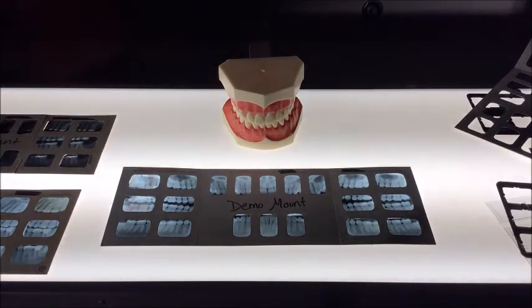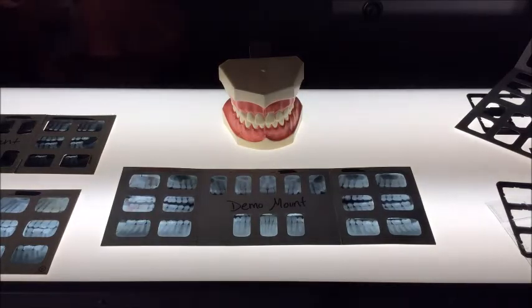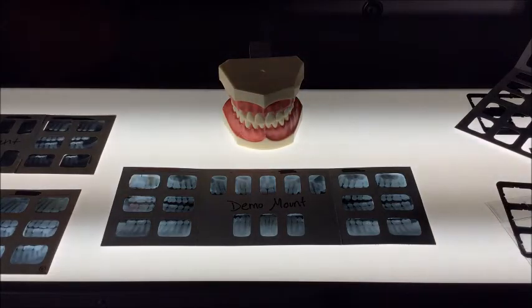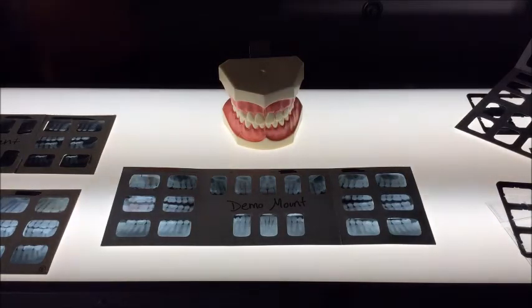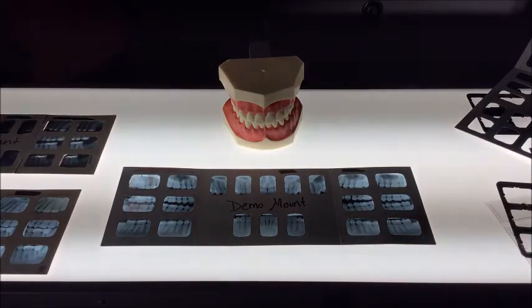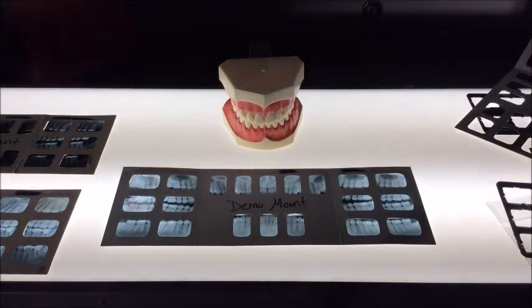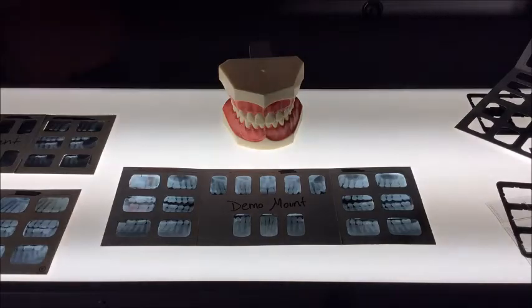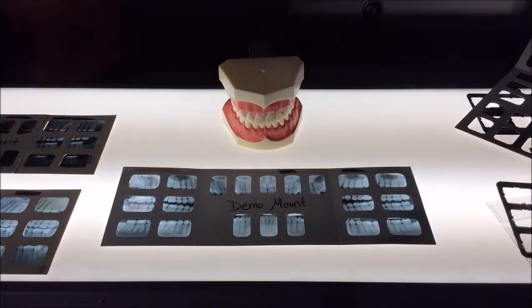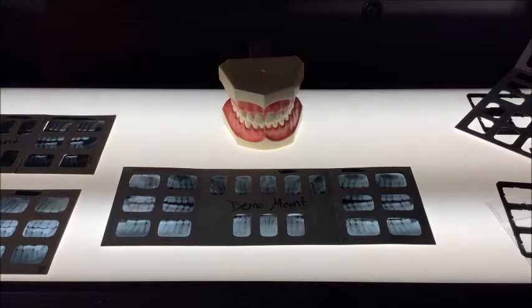The definition of film mounting is the placement of dental radiographs in a holder arranged in an anatomical order. The advantages of film mounting are that films are much easier to view than single individual films. It decreases the chances of error caused by confusing right and left sides for the provider and the patient. There is less handling of the radiographs, which can result in fewer scratches or fingerprints. It's easier to store versus being stored in an envelope.